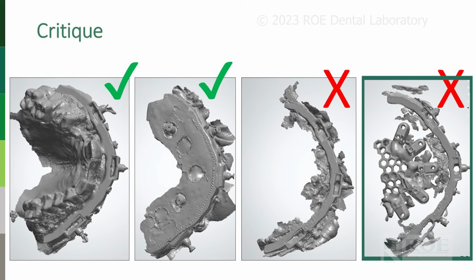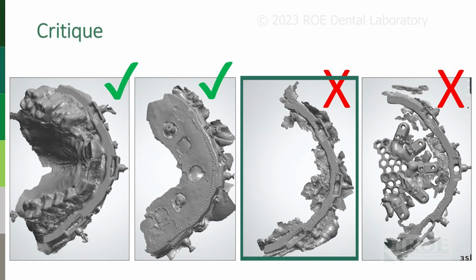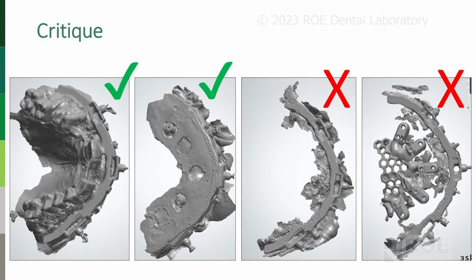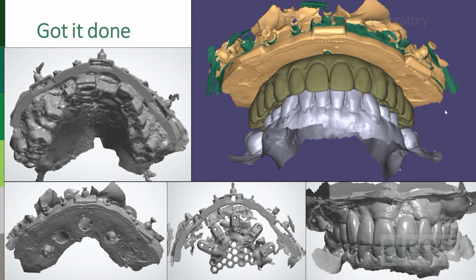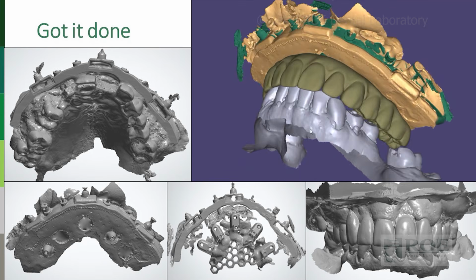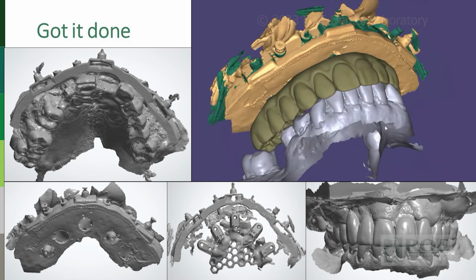We don't need the fixation base and the opti-splint in the mouth. It's an extra oral scan, right? Make sure that if you scanned this fixation base with the healing collars, you actually captured all the healing collars. That's why we make the carrier guide. All right, so seat that and pick up everything. It's not necessarily the more scans you give us, it's the better scans. These are the scans for the surgery, not the ones that had an X. All right, so just follow the checklist.